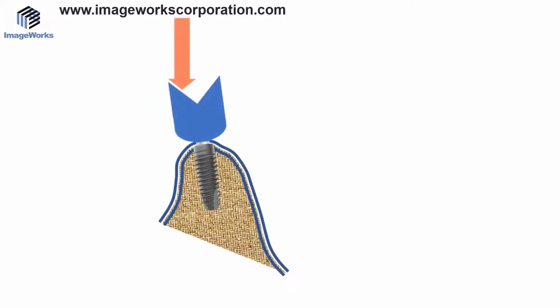When an implant, or a tooth, makes contact with an opposing force, the resultant line of force is perpendicular to the impact area surface. So in this example, even though a force may be exerted straight down, the angle of the contact point redirects that force at an angle. Now, to determine the impact of the torque, we compare the line of this force to the center of rotation, which is essentially acting as a fulcrum. Most commonly with an implant, this center of rotation is going to be located near the crest of the ridge.